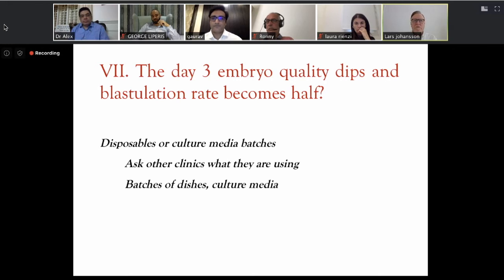Also you should be aware of the Monash study, by Sally. They looked into the disposables and measured VOCs, and embryo tested dishes and disposables were high in VOCs. So just because they're embryo tested doesn't mean they're non-toxic. That's a learning curve for me when I saw this data.